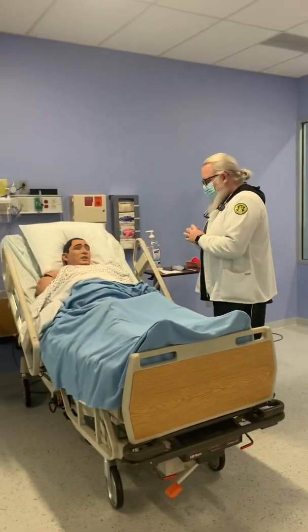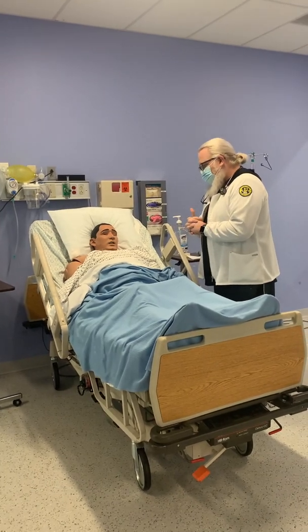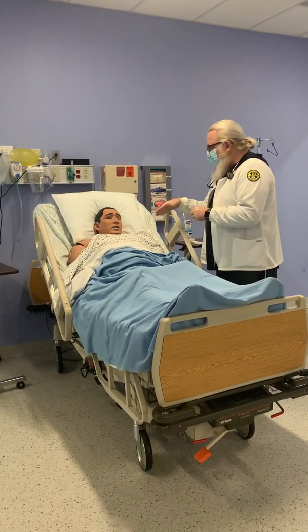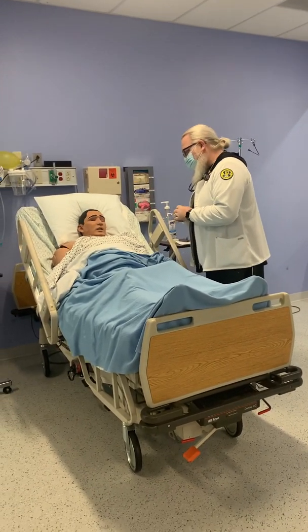Hi, Mr. Red, it's Dave, student nurse again. The doctor ordered an NG tube. There's some blockage, so we want to get a tube. We're going to insert it into your nose, down into your stomach. Can I just get your name and date of birth, please?